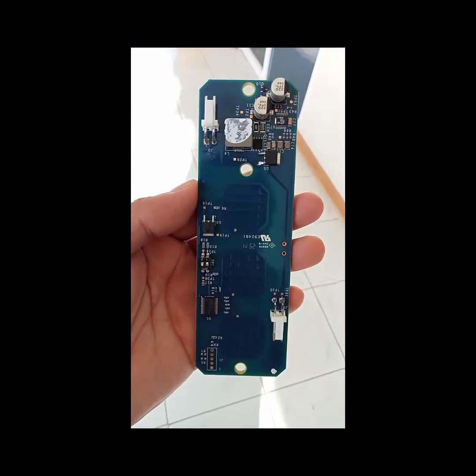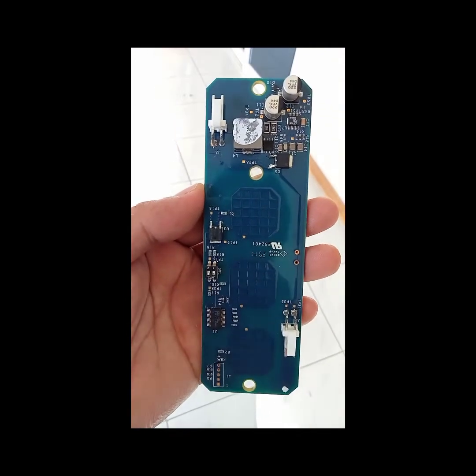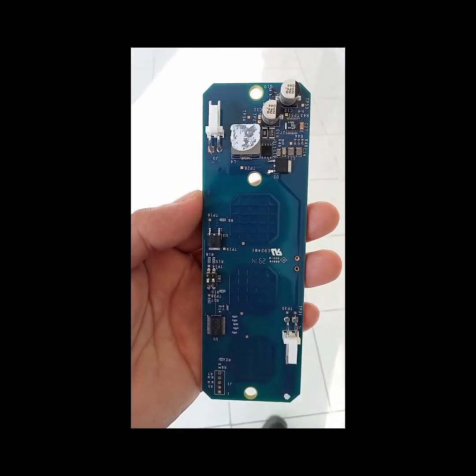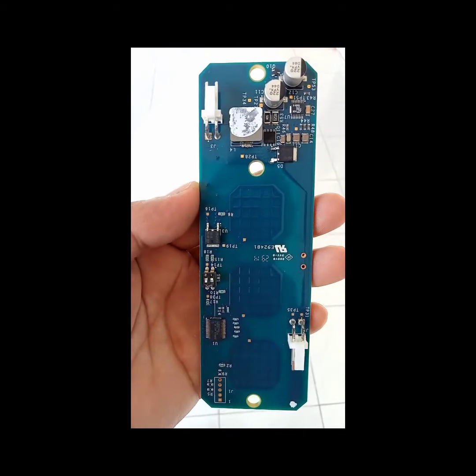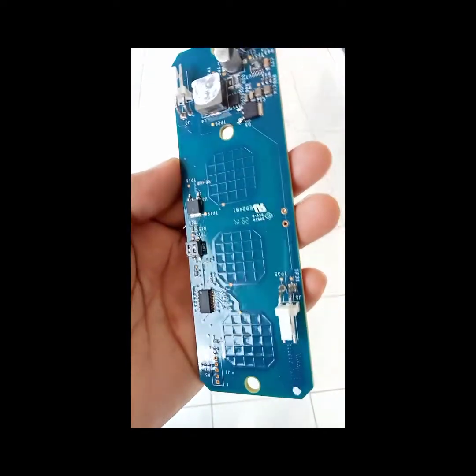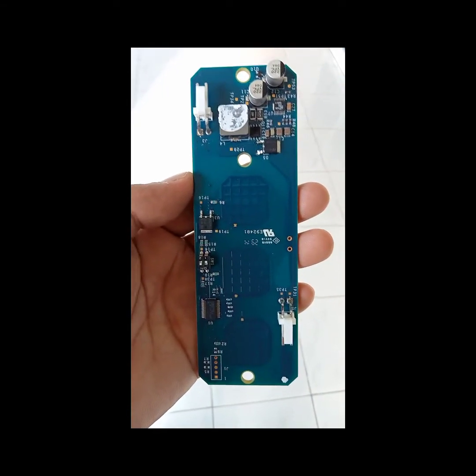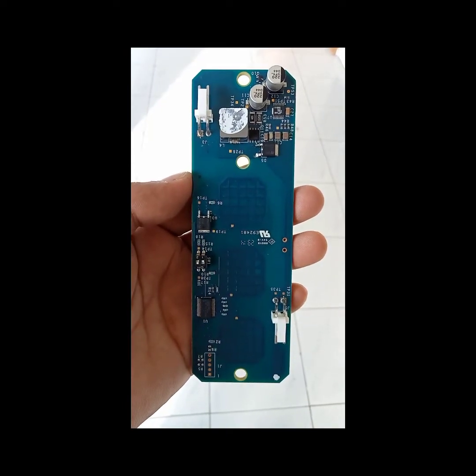I already checked all the components and I think there's no problem with the board. The next thing to do is we're going to install it back, and I will try to check the connection between jumper 3 and jumper 5. Then we'll try to test the surgical light again.